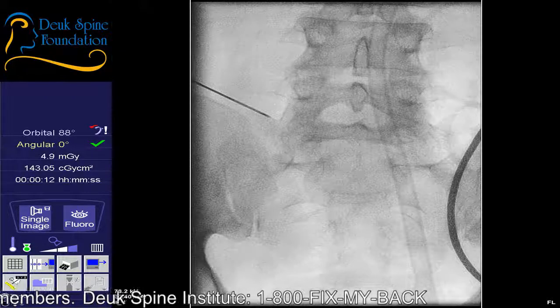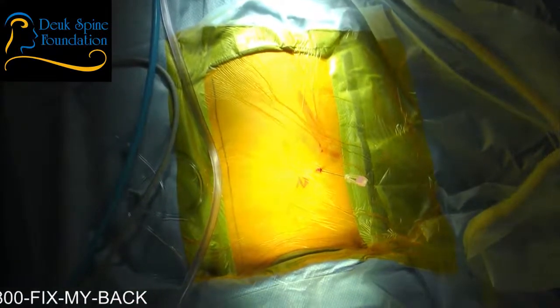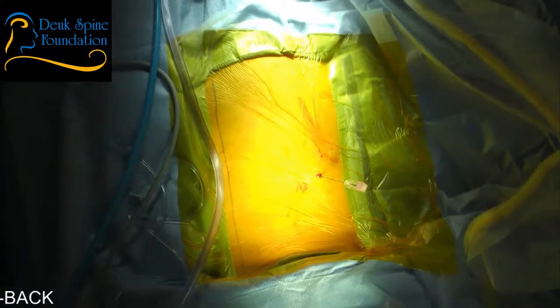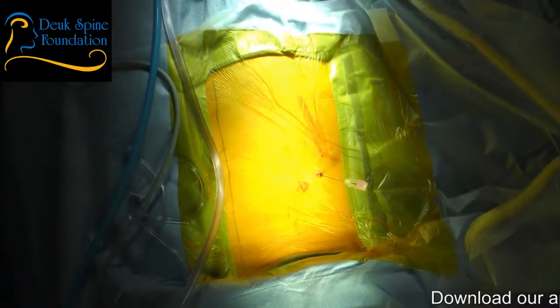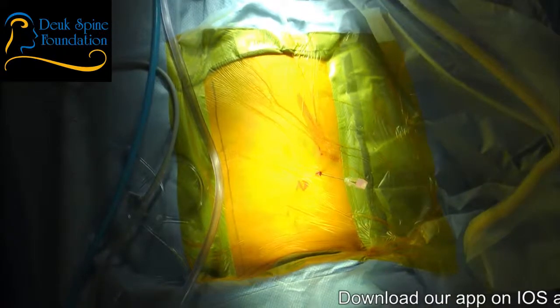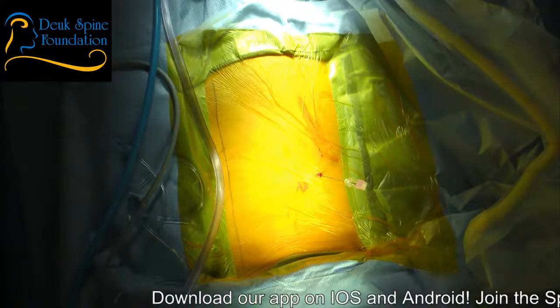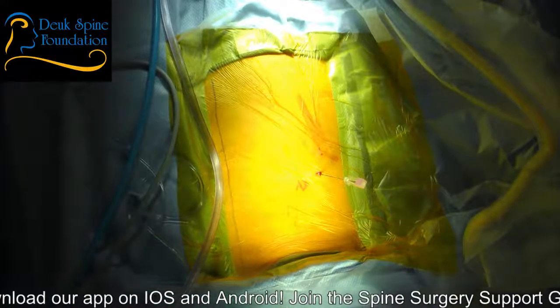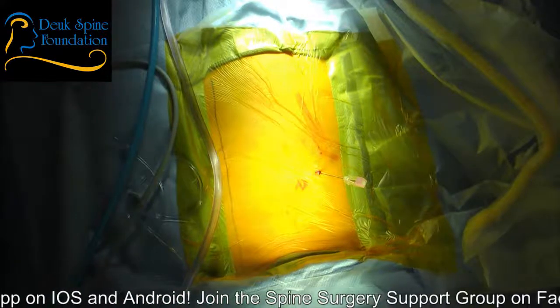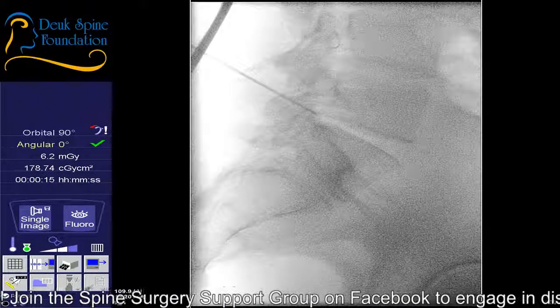Did we get that foot issue fixed for you? Yeah. All right, good. Still some pressure? All right. I need you to go up and down here till you get those facets lined up. You see them? Right where the tip of the needle is? Go up, take a shot, then go down, take a shot. That's worse the other way. More down. Shot. That's better. I think we overshot it there. That may be as good as we're going to get it right there, so just leave it there.